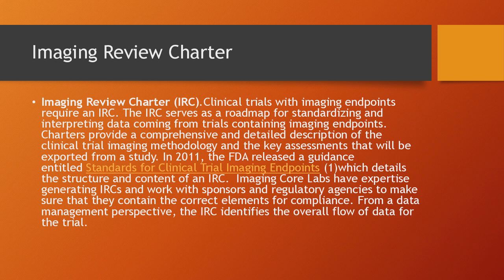Keybeam, as an advanced quantitative imaging core lab for clinical trials, we have to have, let's say, a quality management system. And one of the big pieces of this quality management system is the imaging review charter, right? Obviously, the imaging review charter in the end is customized for every clinical trial or clinical study.